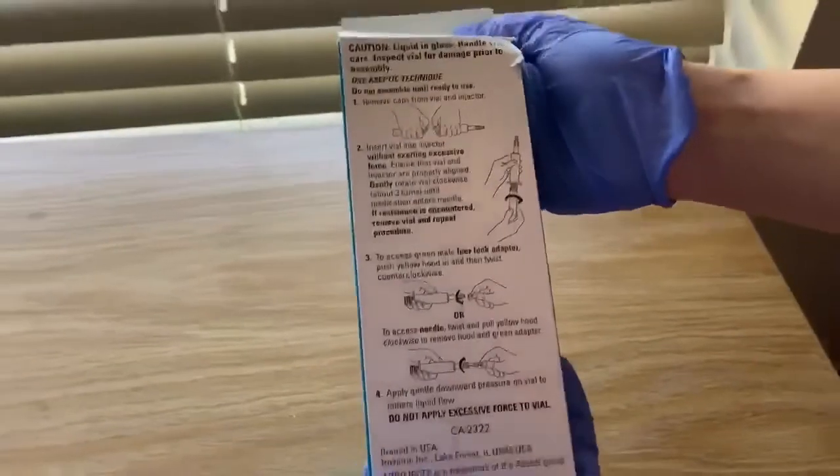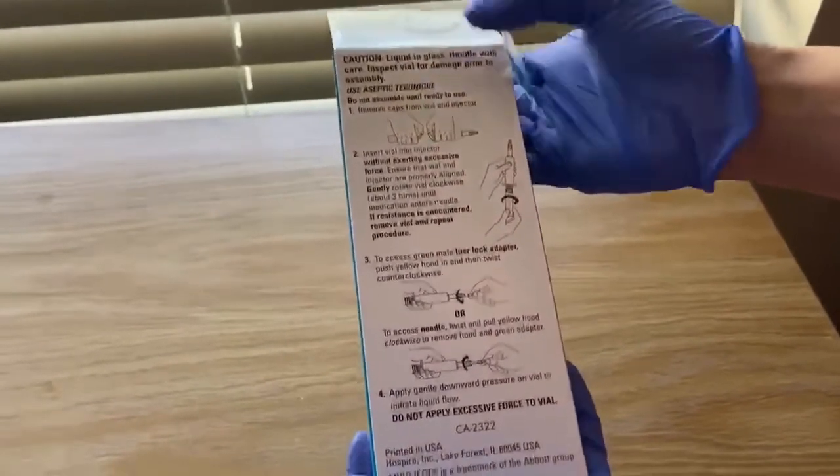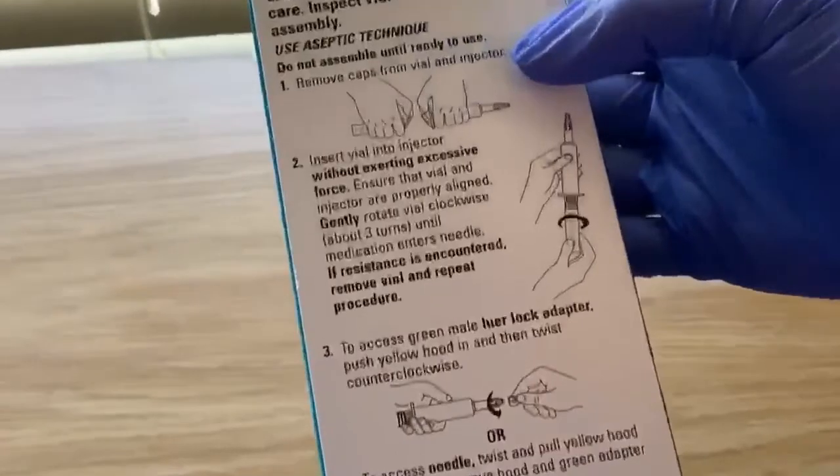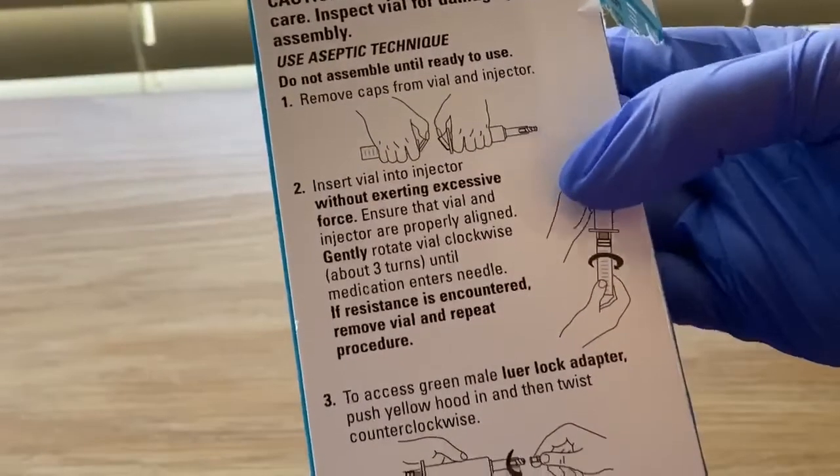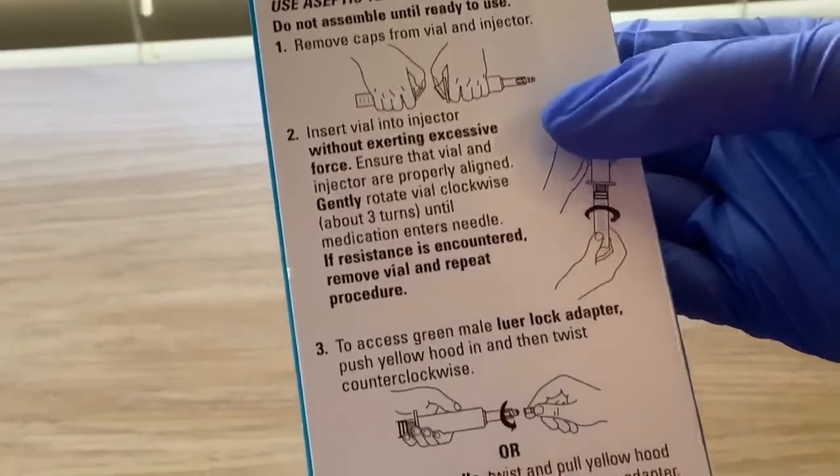It's usually located in the medication room or the Pyxis. On the back here you'll find that they do have directions, but we're going to walk you through this. So don't be intimidated at all, because at first we were intimidated by this too — but it's really quite easy.